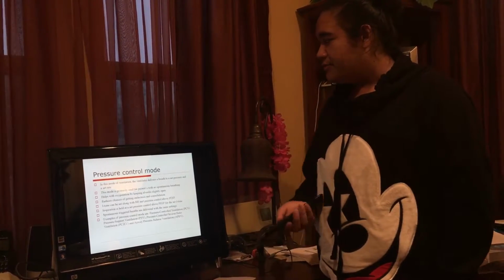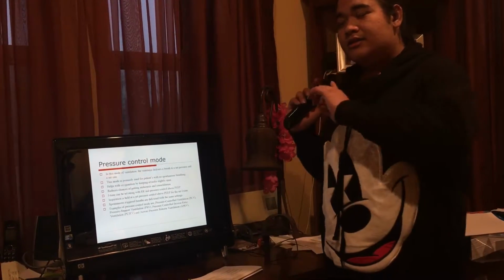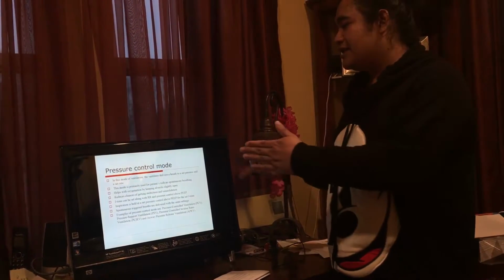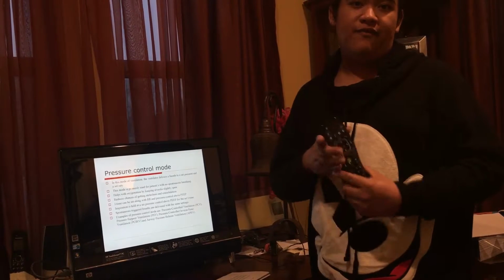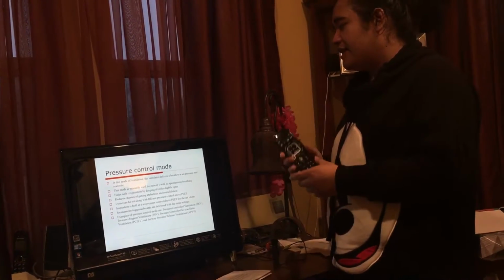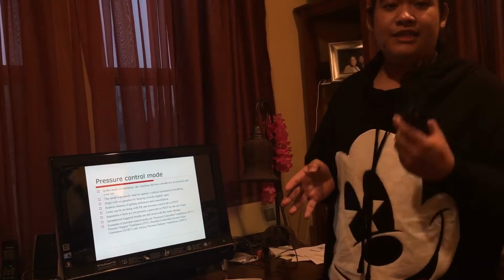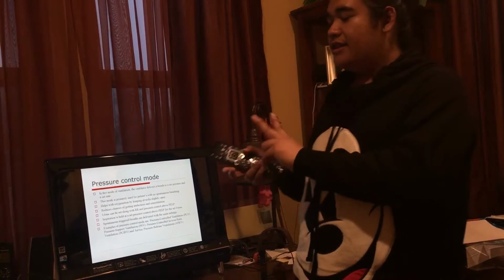Now let's move on to pressure control mode. What is pressure control mode? It's kind of a vice versa of volume control. In this case, we are setting a pressure and the volume will be variable. This mode of ventilation delivers breaths at a set pressure with a set rate.